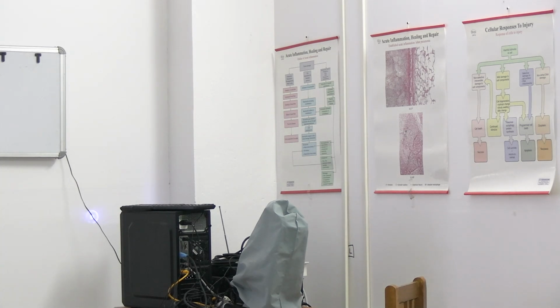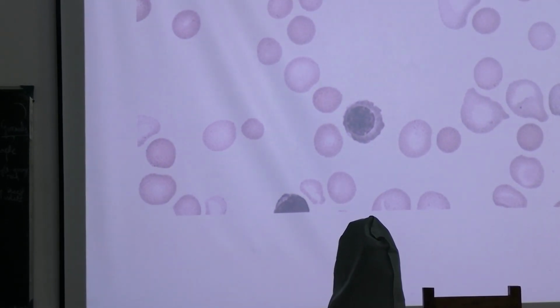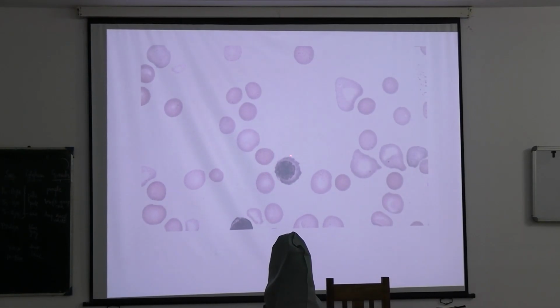Is it necessary to describe the lymphocyte? It is very clear cut, anyone can identify. So, can this cell fit any of those descriptions, whether lymphocyte, neutrophil, monocyte, or eosinophil? Then which cell is it?